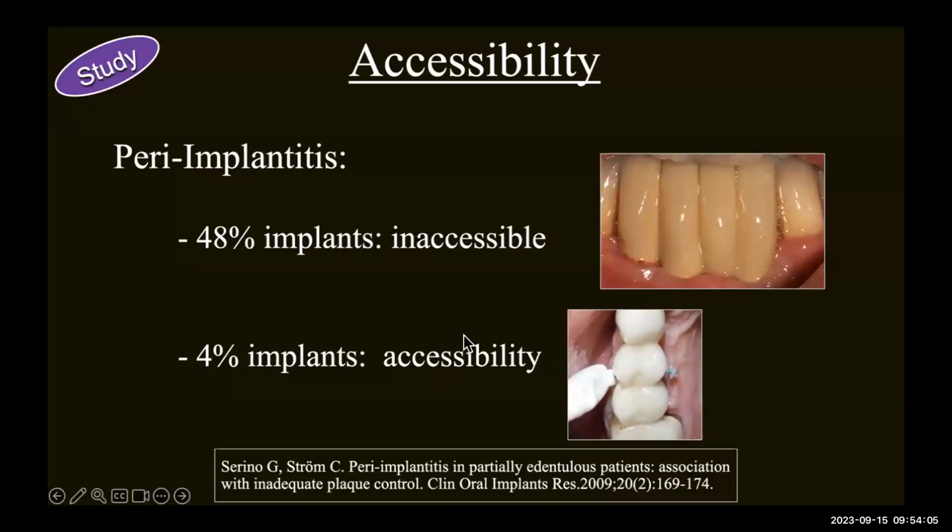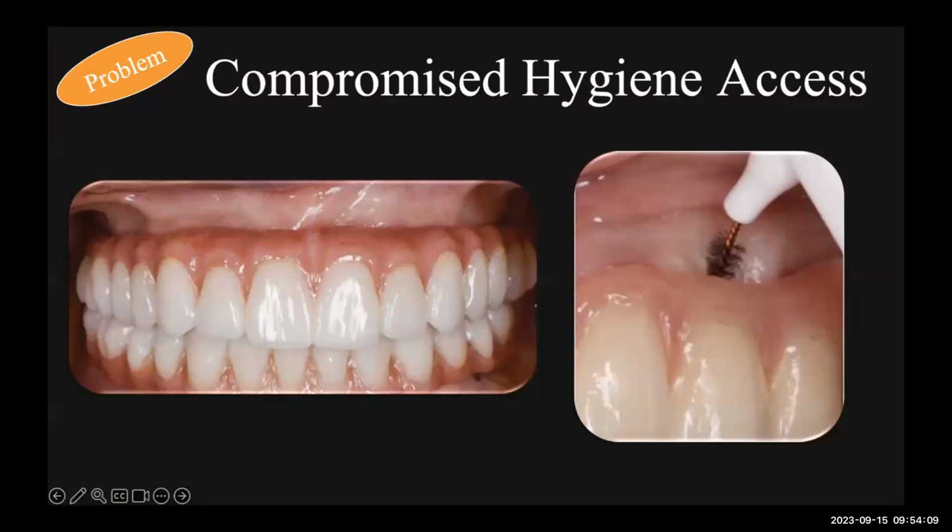So that just is an alarming study that shows how important it is to have an open prosthesis. However, because aesthetics has taken over so much of dentistry and everyone wants to please the patient, the labs put ridge laps on here because they don't want doctors sending it back to have it placed on later because the patient didn't like it, but you still have to clean.